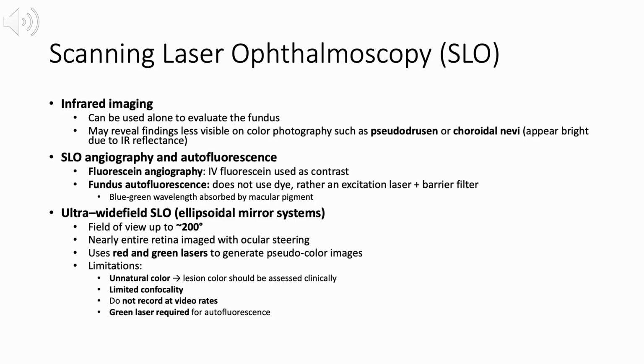Ultra-wide-field SLO systems, which use ellipsoidal mirror designs, further extend retinal visualization. These systems provide a field of view of up to approximately 200 degrees, allowing imaging of nearly the entire retina with ocular steering. Pseudocolor images are generated using red and green lasers. However, there are important limitations. The color appearance is unnatural, and lesion color must be assessed clinically. Confocality is limited. Images are not recorded at video rates, and a green laser is required for autofluorescence imaging.